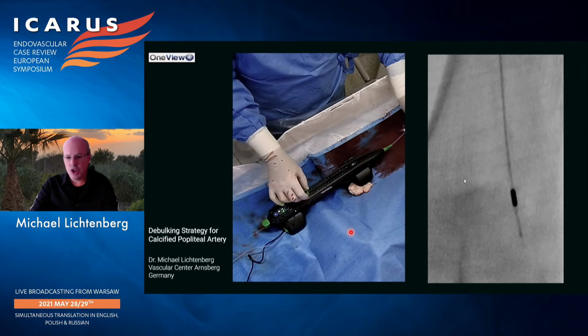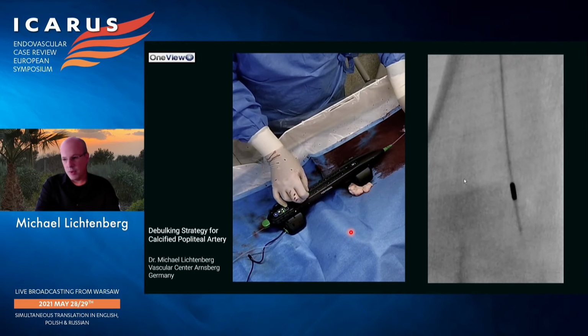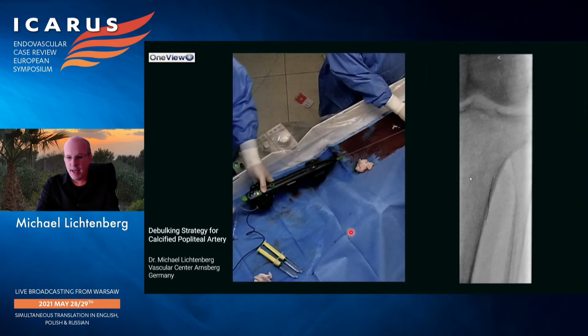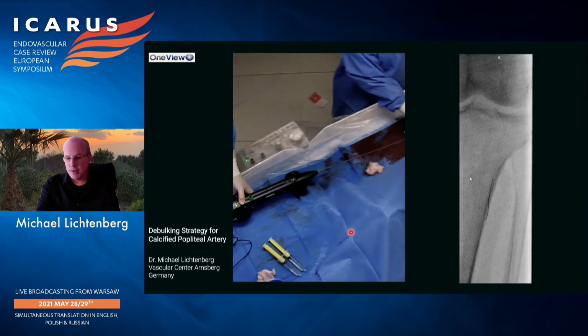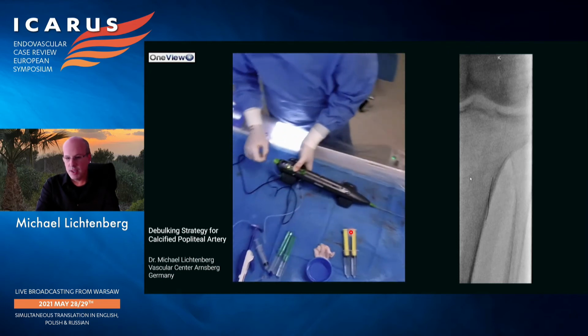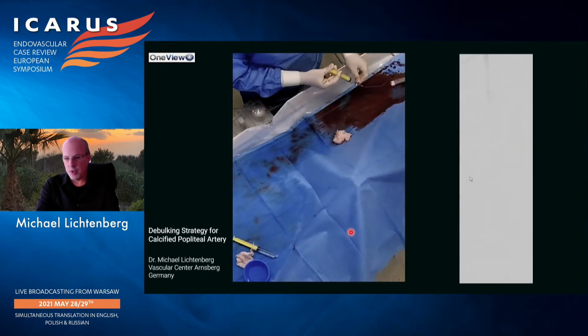This diamond-shaped catheter really works on the surface of the calcium and then creates a lot of powder, which is just flushed out into the microvascular bed and out of the artery. This is the principle of that. You don't need a filter. You don't need any other expensive devices to prevent distal embolization. Distal embolization is definitely not a problem with the device.